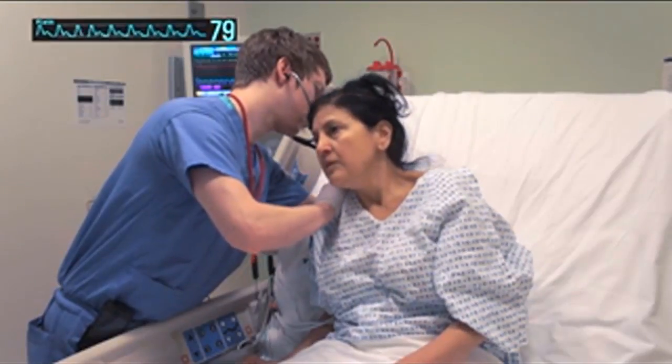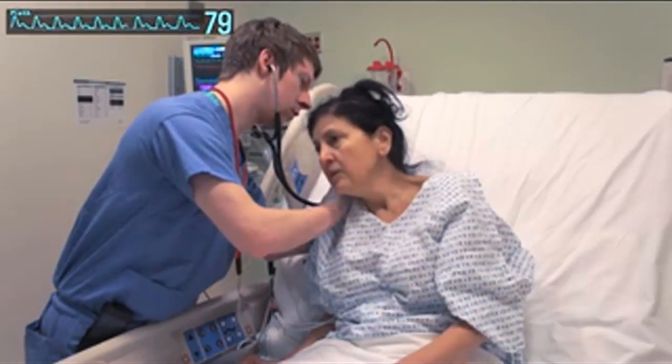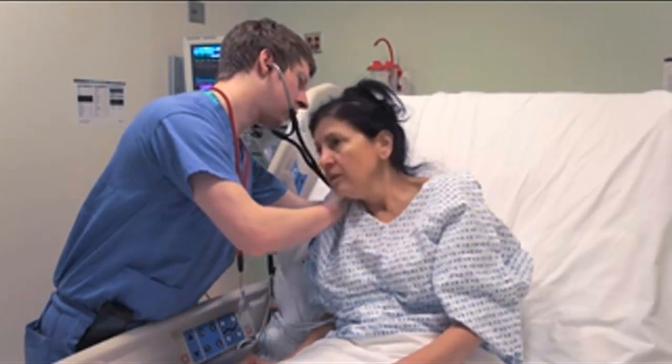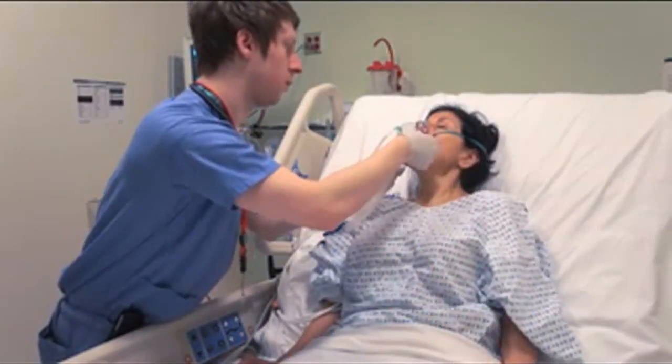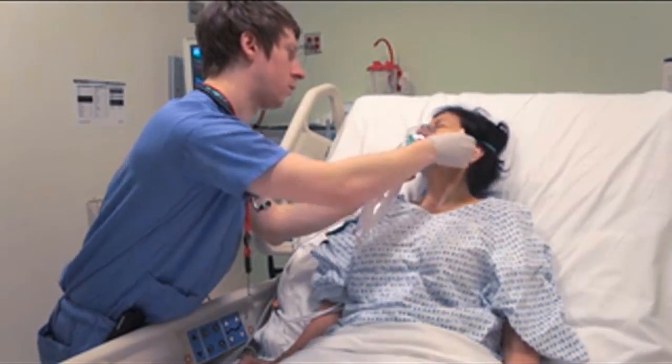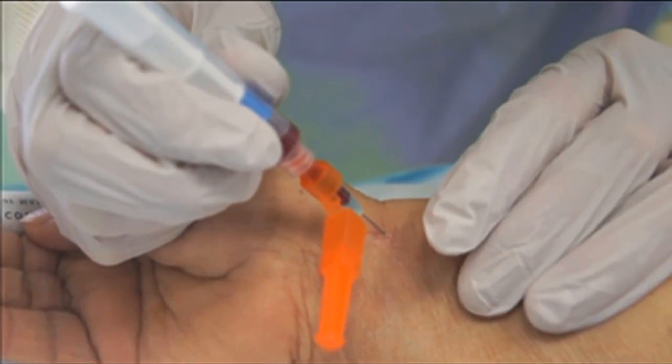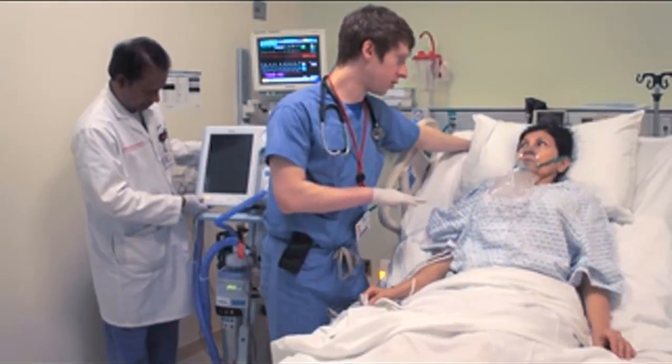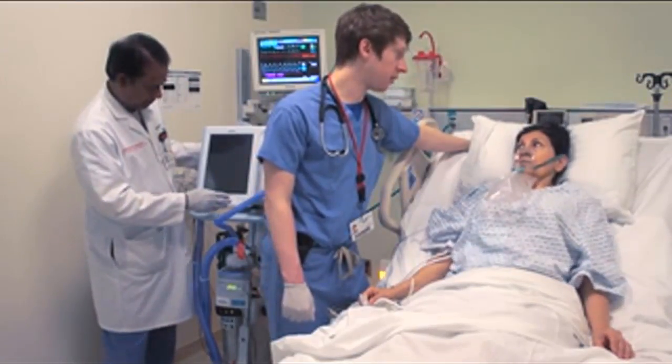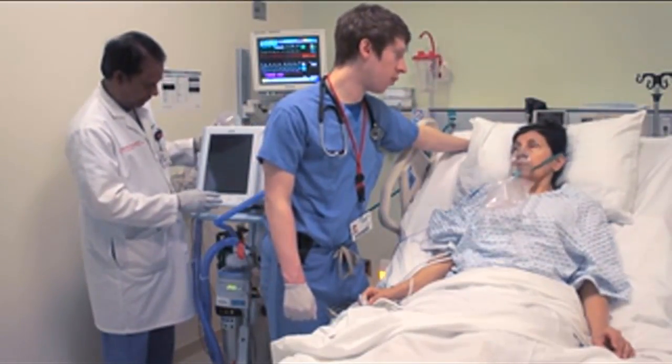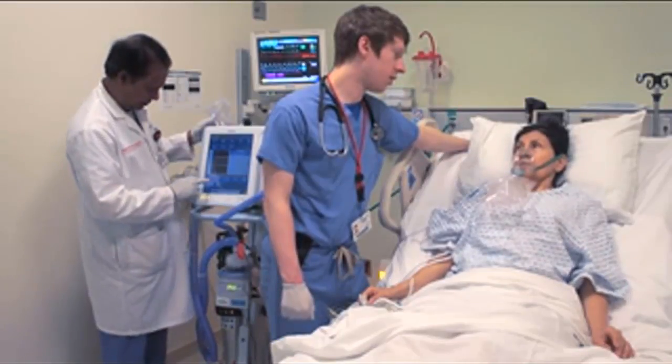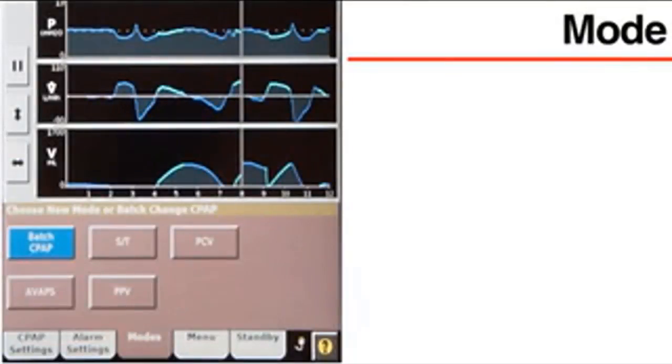When a patient is in respiratory distress, provide initial support and call for the help of a trained respiratory therapist who can set up the ventilator and troubleshoot any technical problems. If time permits, obtain a baseline measurement of arterial blood gases. Describe the essential features of BPAP to the patient. Doing so usually helps decrease anxiety and may improve tolerance of the treatment.